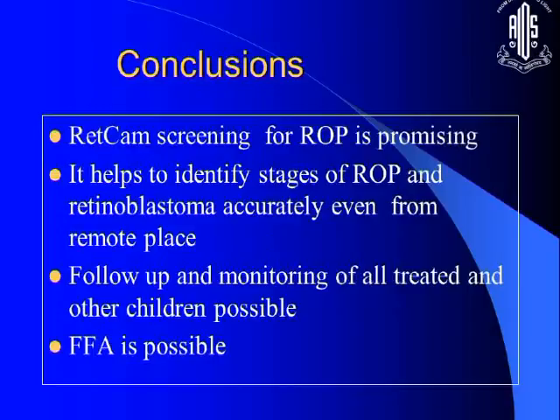I think we're going to have devices which are going to be much cheaper. This is going to be the way, I can tell you, which will go to these sick newborn units which are being opened up in every district of India by the Government of India under NRHM. So that is where we are going to have a challenge, and all of you would see floods of ROP cases coming. And it helps to identify the stage of ROP.